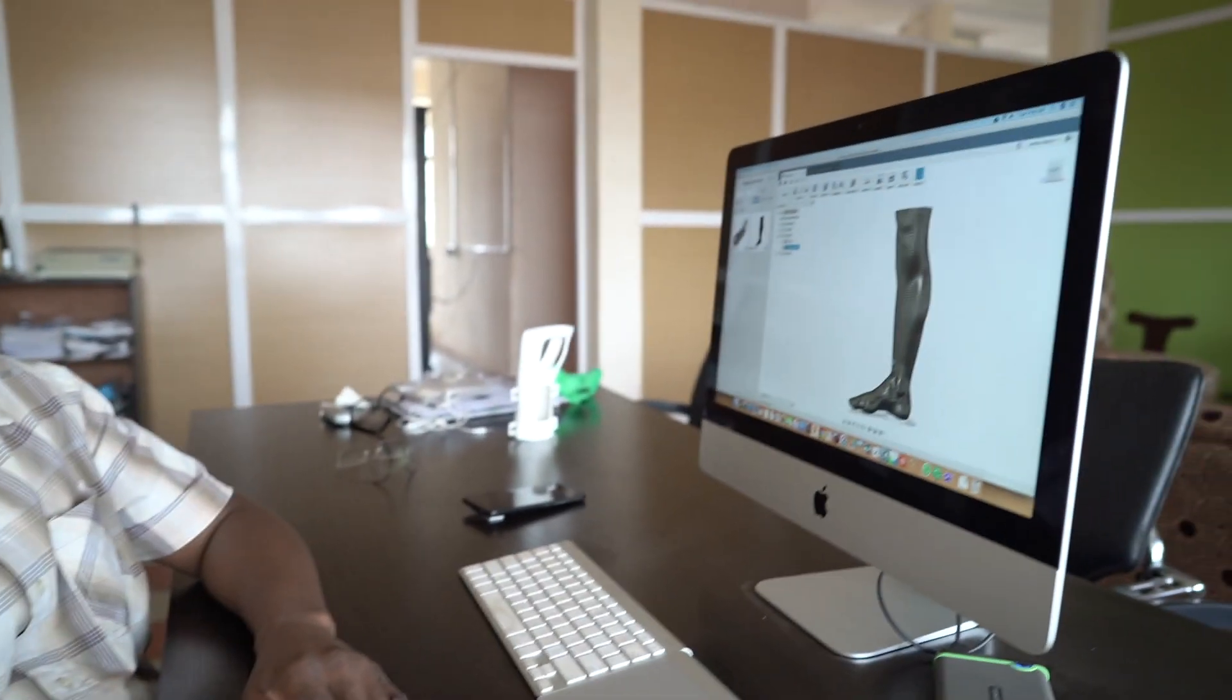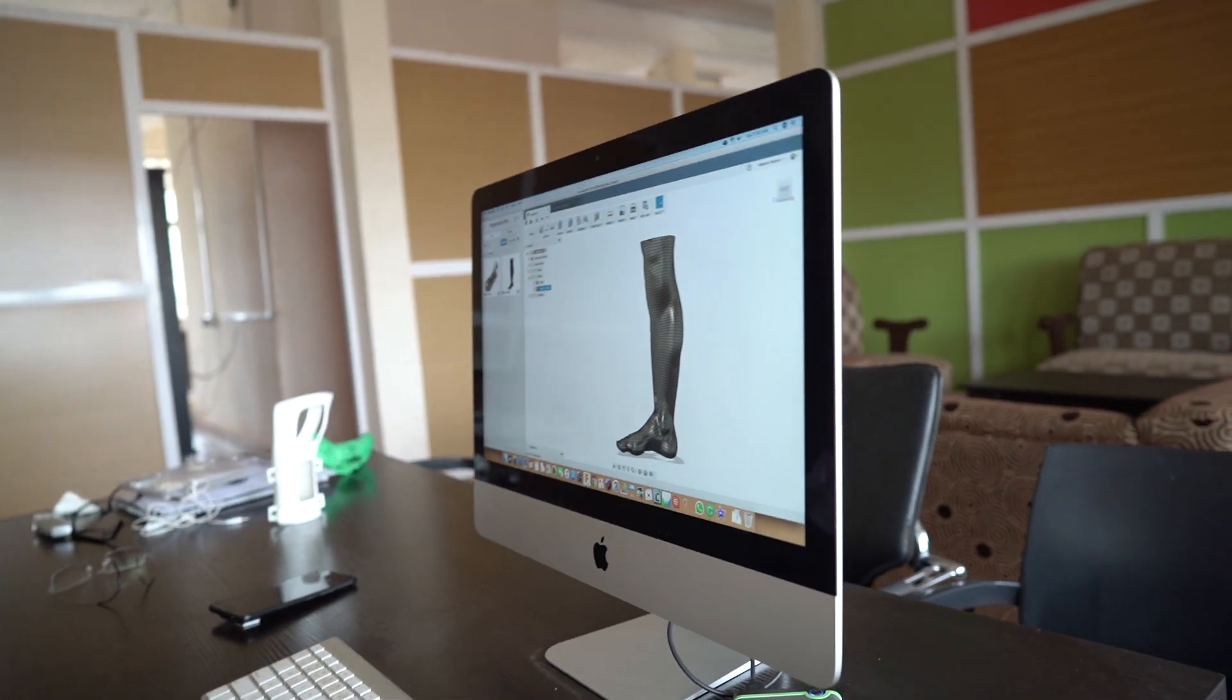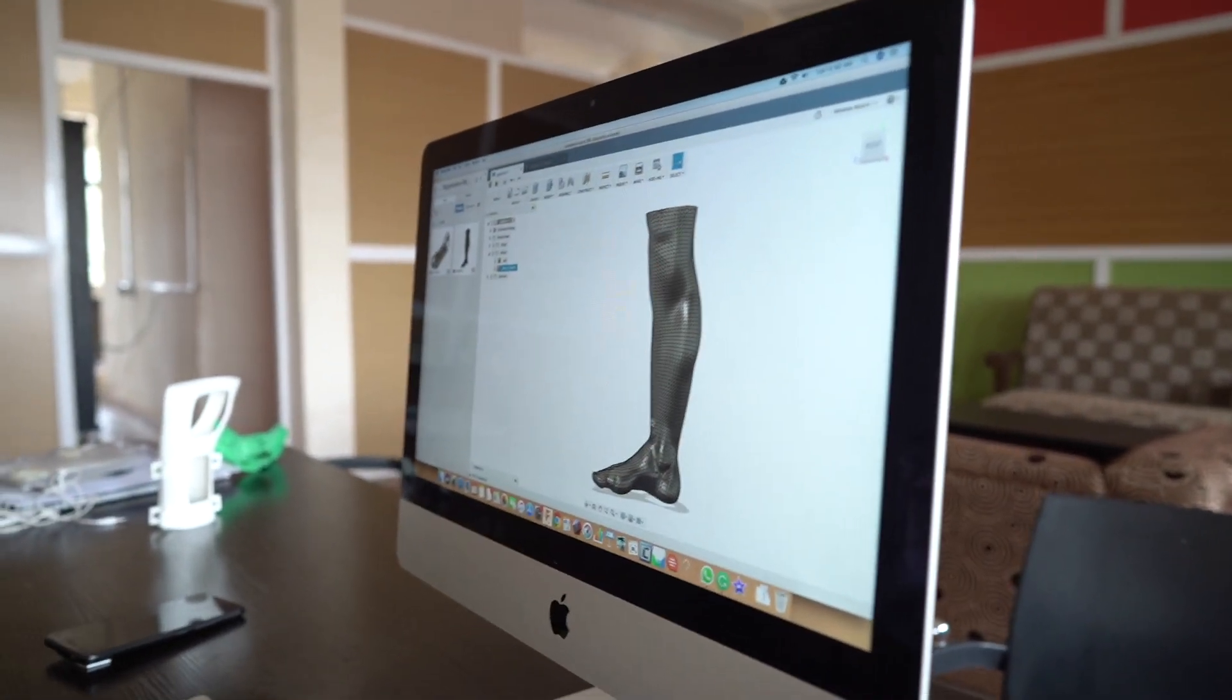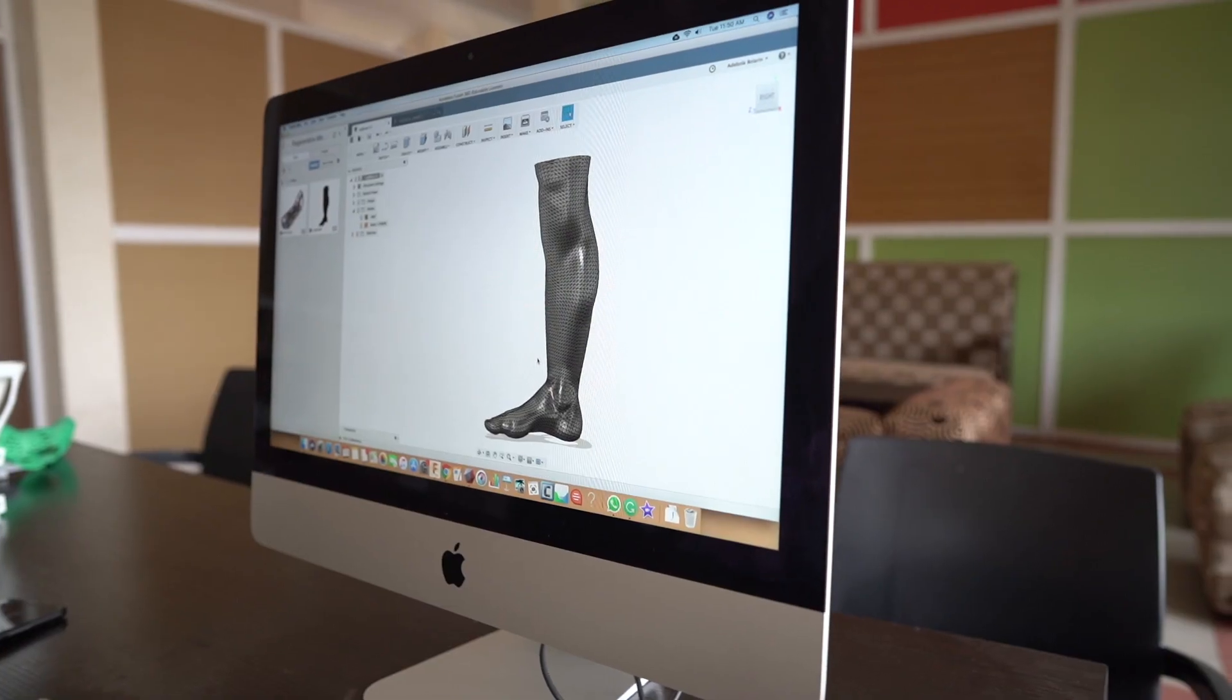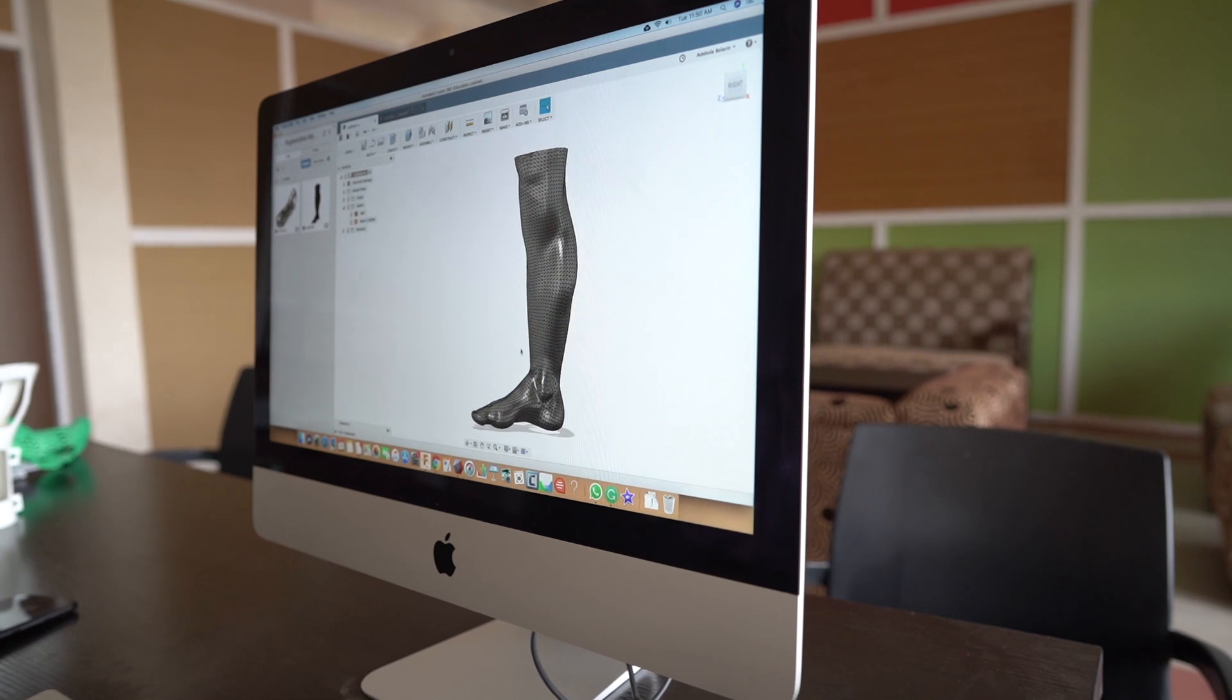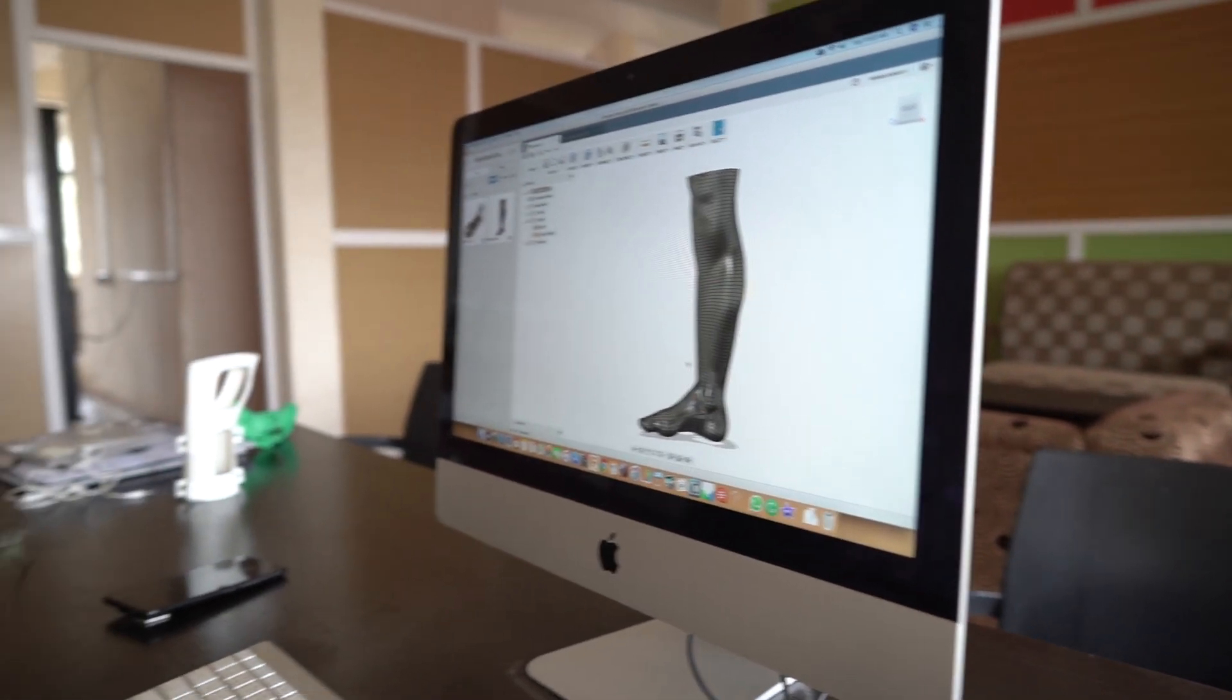The process is: first, we scan the body part that we're going to build the brace, cast, or splint for. For instance, if a left leg is broken, we'll scan the right leg and do a mirror in the scan.